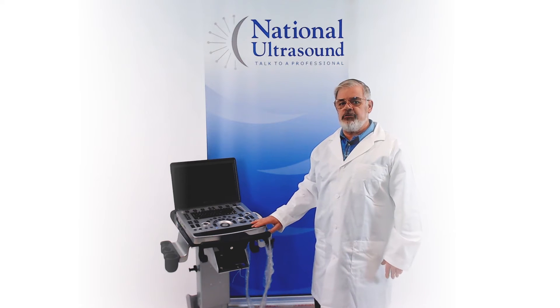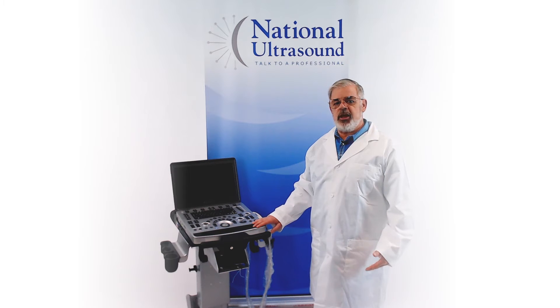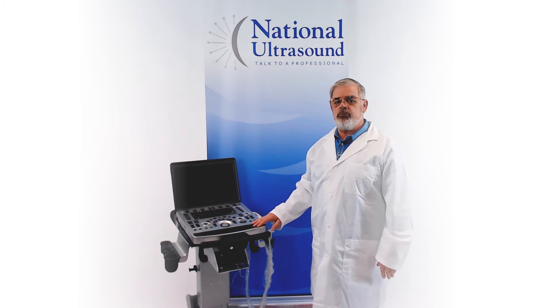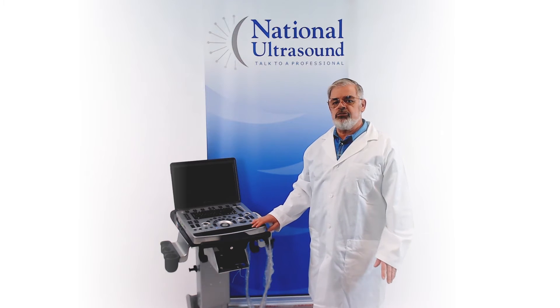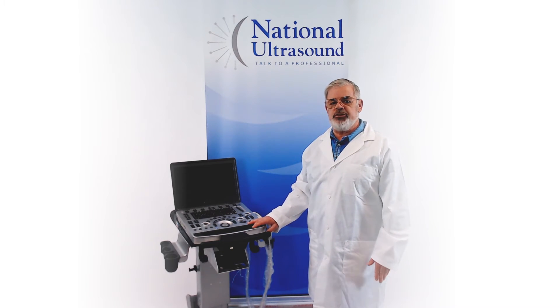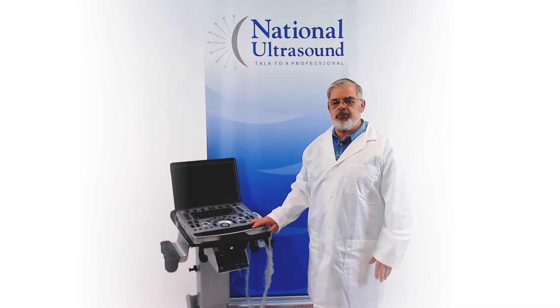Today I'm reviewing the Mindray M9. The M9 offers a high-performance platform based on advanced technologies. This compact, portable ultrasound delivers powerful, reliable performance with advanced system processing, single crystal technology, and many more features. The key features include the single crystal transducer for better penetration, echo boost cardiac image optimization, along with a solid-state hard drive for improved speed and reliability.